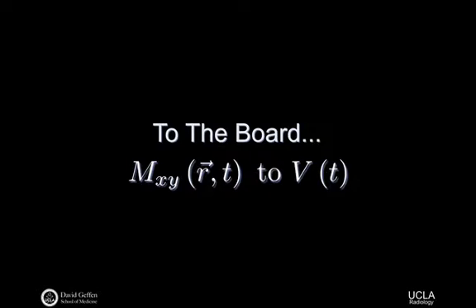And then this time we had a sine term, and the sine term is going to stay. So we should have a sine, small bracket, times minus omega as a function of space times time plus the phase from the RF pulse, which can vary over space. That's our first term. Our second term, of course, looks pretty similar to the one that we had above it. We have a minus sign this time. So we have a minus e to the minus t over T2 star as a function of space. And that's multiplying onto something like omega of r cosine this time, a bracketed term that looks like minus omega of r t plus phi RF, which is a function of space.